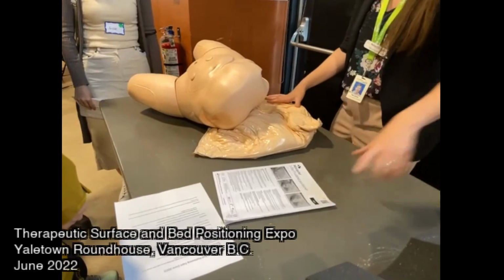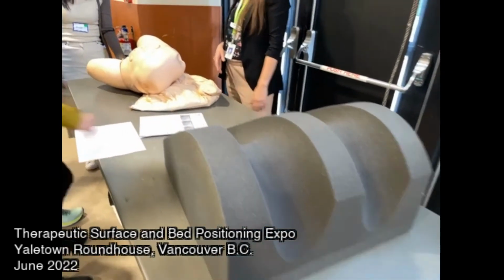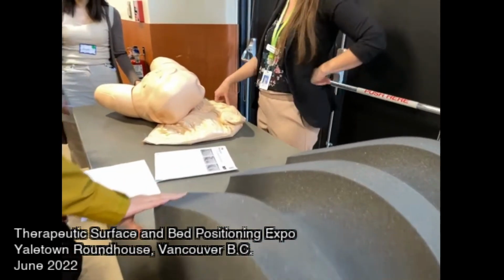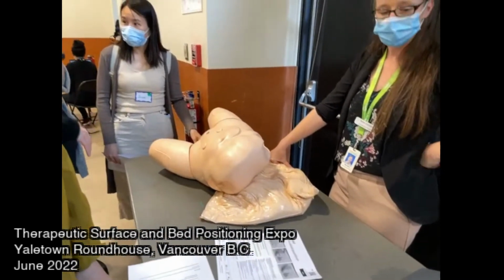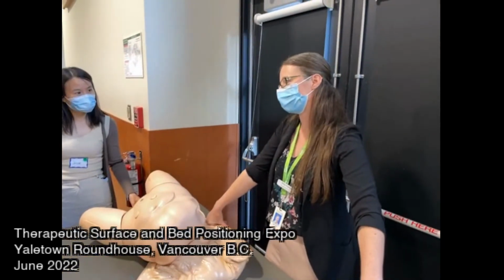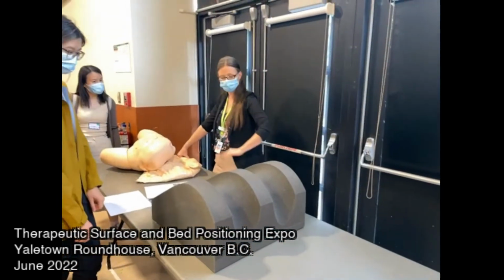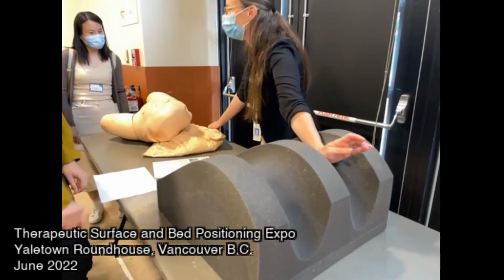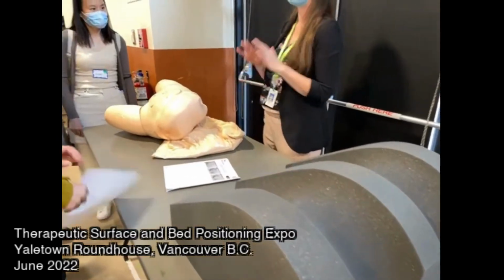So those are awesome. And then this is with the heel option. Yeah, so this one is really for somebody that is not able to move. They're going to stay in that position. You don't want them moving to the heels here or up here. So it is definitely for somebody not as mobile.